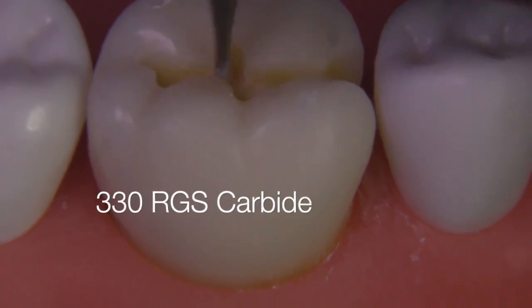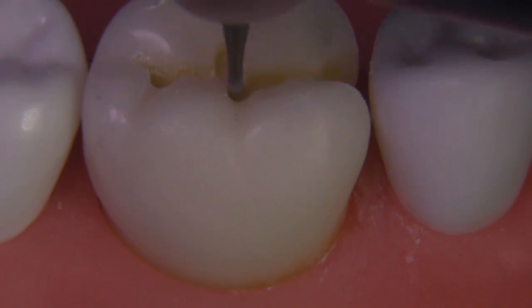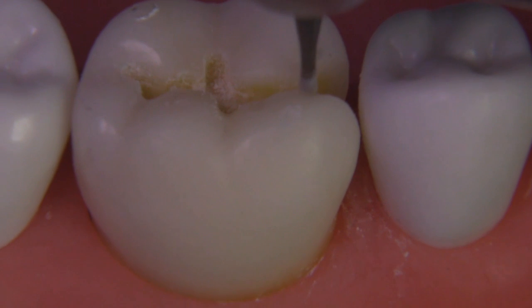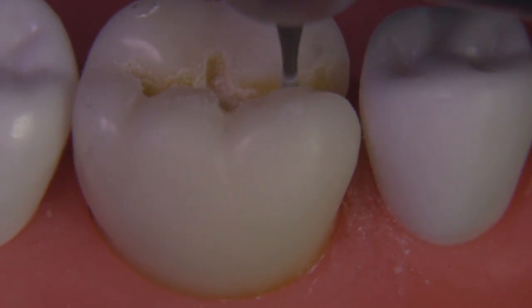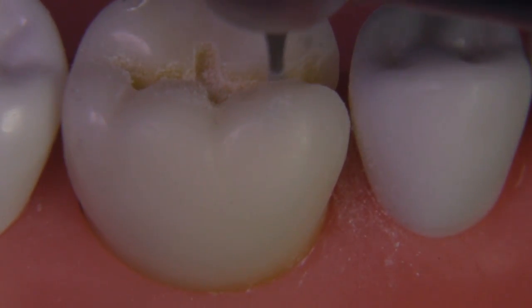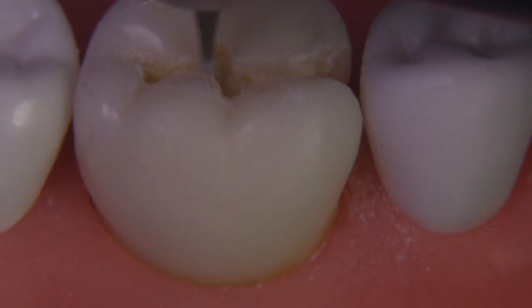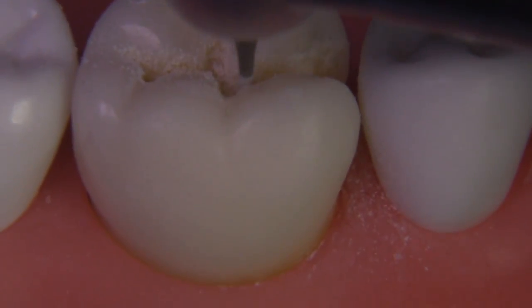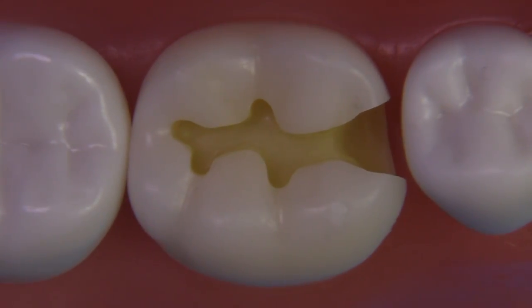Now we're going to go over the outline form and finish up all the smoothing with a 330 RGS bur. This is going to be used to blend any sharp edges away and create the S-curves between the occlusal and the box area as well. I'm utilizing the slow speed at this point, but you could clearly do this with a high speed. Just be careful going around the preparation, realizing that the material in the enamel area is quite hard and the dentin area is actually quite a bit softer.